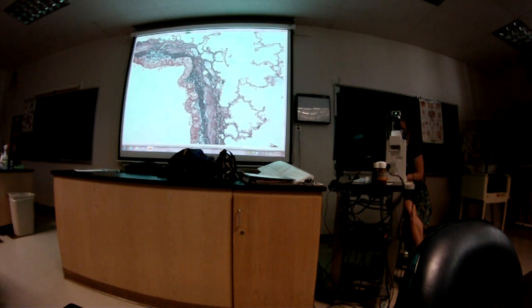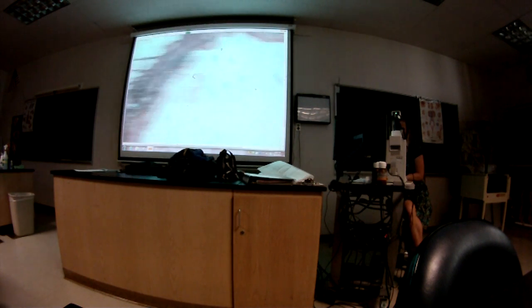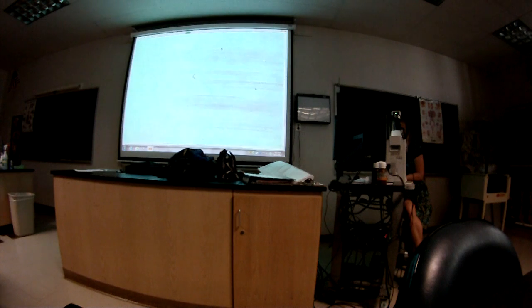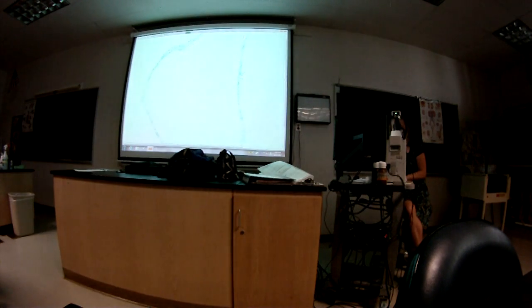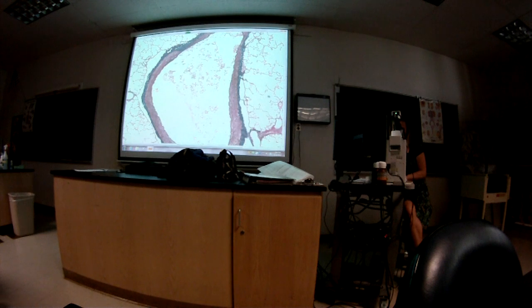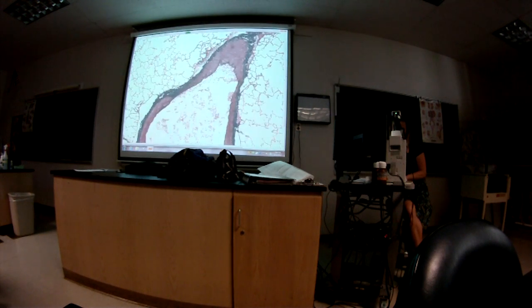Okay, so number 9 was bronchiole. Any other questions on that one? It is simple cuboidal. Yeah, that wasn't on your lab list, though, and I don't think I added it, so we'll have to ask that specifically.